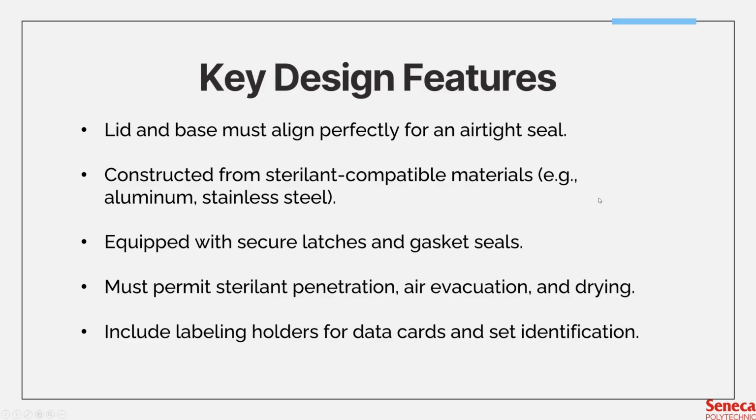So, some key design features. For a container to function properly, several design features must meet regulatory standards. The lid and base must align perfectly to form a complete airtight seal. Containers are built from sterilization-compatible materials like anodized aluminum or stainless steel.